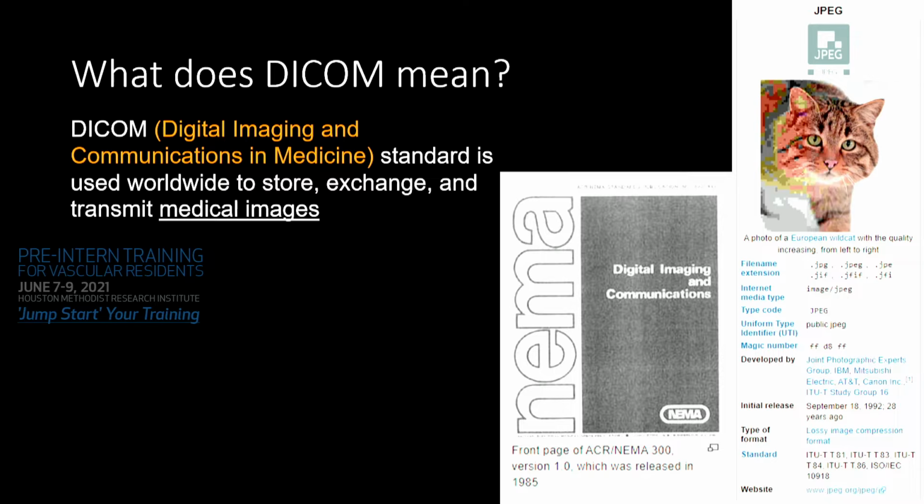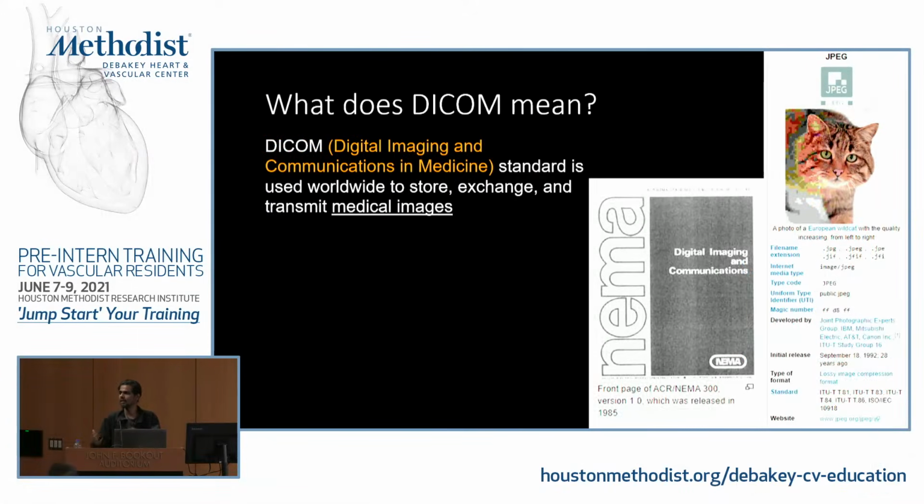And currently, we don't have such a standard for video recordings, for example, in surgical cases. So these are some of the areas where there is still a lot of improvement. Most of what you see in the operating room is documented as an MP4 or a picture, which doesn't often get into PACS, and you're relying on what a surgical note is based on what a fellow or a surgeon dictated at the end of the case.